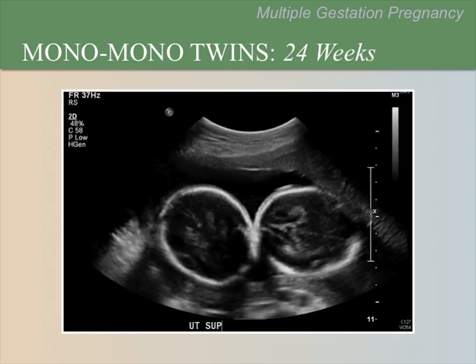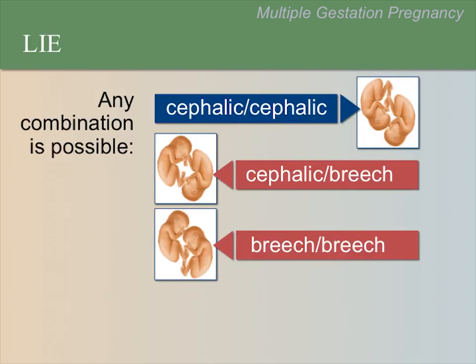This is a scan taken later in the same pregnancy. Again, notice that there is no separating membrane between these twins. It is important to note the fetal lie of the twins as the time gets closer to delivery.